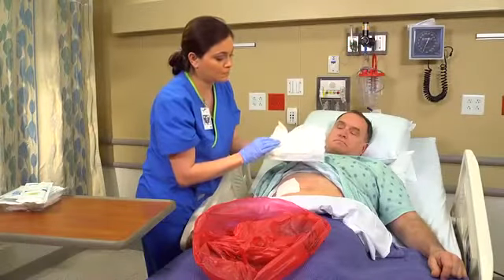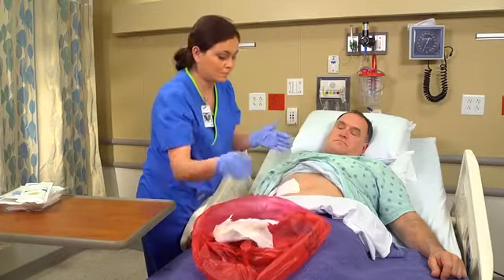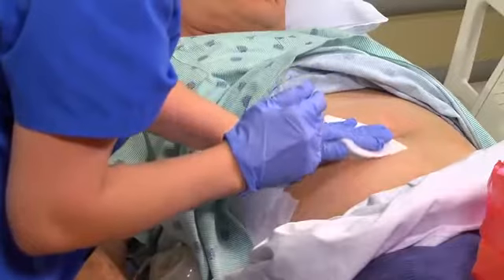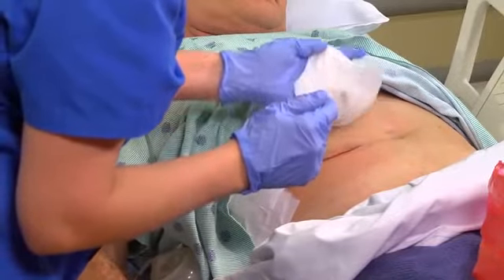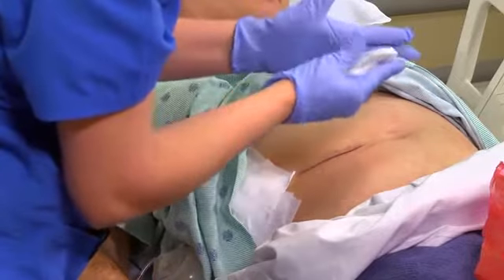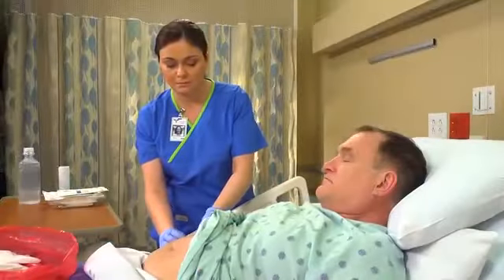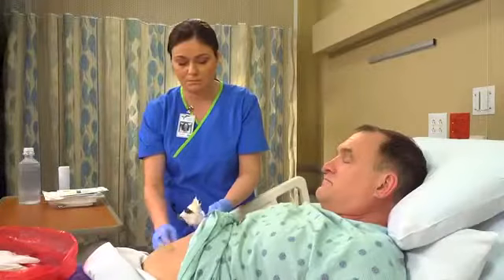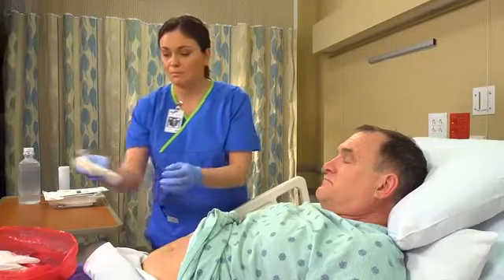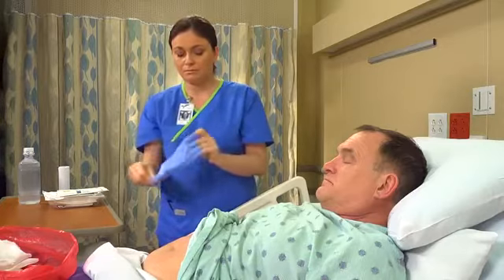Carefully discard the outer secondary dressing first, followed by the inner primary dressing — the layer that's in contact with the wound. If any drainage devices have been placed, avoid putting tension on them by slowly lifting away the layers of the dressing. Keep the soiled undersurface of the dressings concealed from the patient's view as you work. Fold the dressing to contain the drainage. Peel off your gloves inside out and perform hand hygiene.